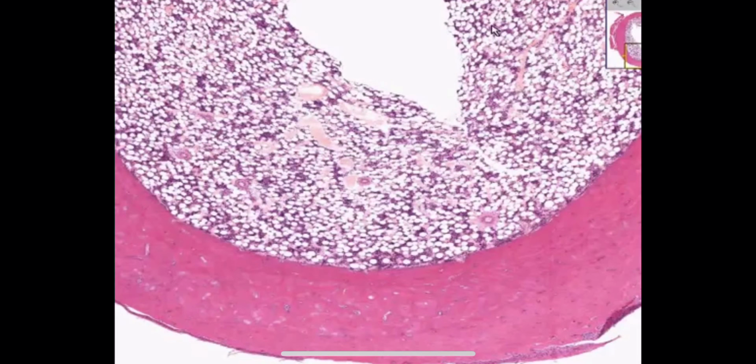Let's take a couple of clicks in here, and I think let's look at the marrow first. You can appreciate that approximately half of this cross-sectional area is washed out fat spaces or adipose tissue. You could see one, two, three arteries at least. You could see veins or venous spaces or sinusoids here, and here, and here, and here, and here.